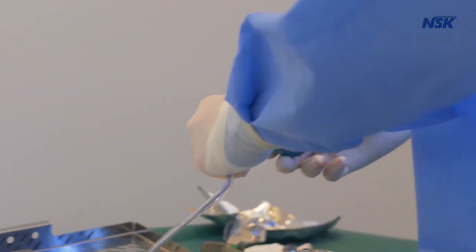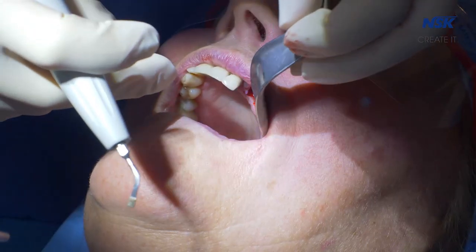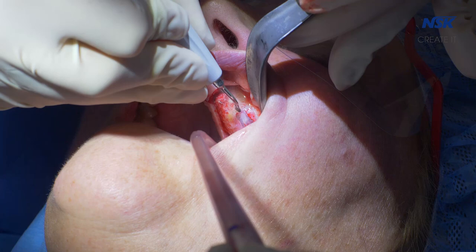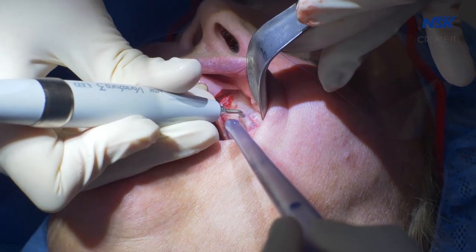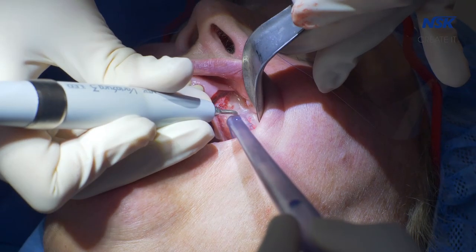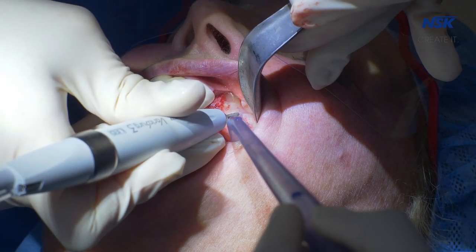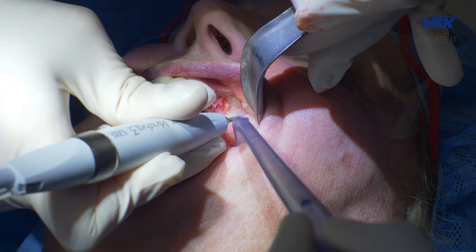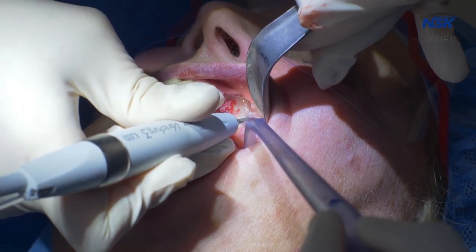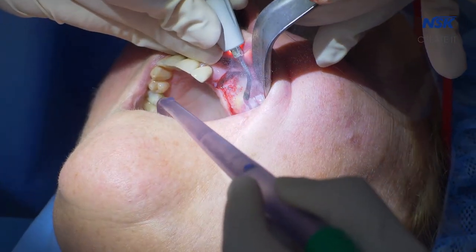When patients don't have enough bone we have to augment the sinus — an open or lateral window sinus lift. It can be a fiddly procedure because you're working with a very thin membrane. You make a window in the lateral wall, which is sometimes very thin bone, then elevate the membrane — which is like the lining of an egg, very friable, requiring very delicate work. Conventionally you'd use a straight surgical handpiece with a round bur, but you don't feel as in control, and if the bur touches the membrane it's likely to perforate. A large perforation may mean abandoning the procedure. With the piezo, the tips only cut bone and don't damage the membrane, which takes a lot of stress away and increases control. My membrane perforation rates are very low, and I feel that's in part due to the control the piezo gives me.